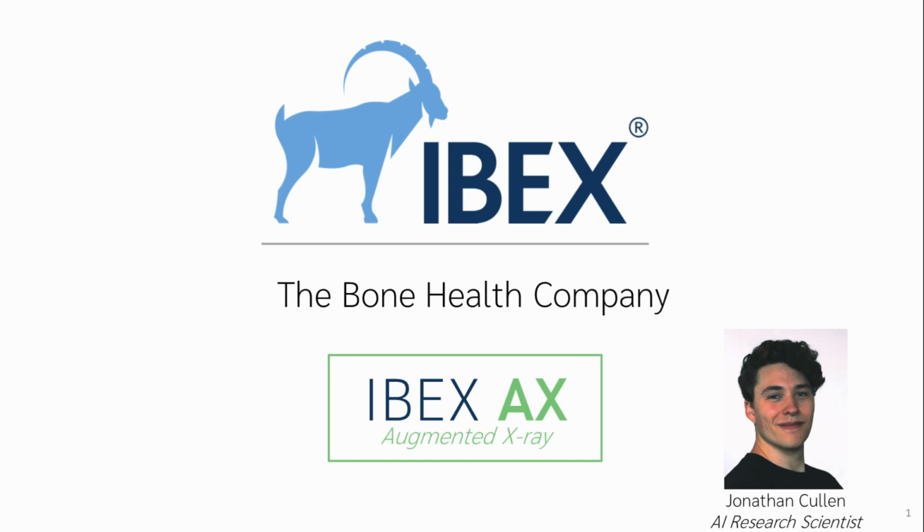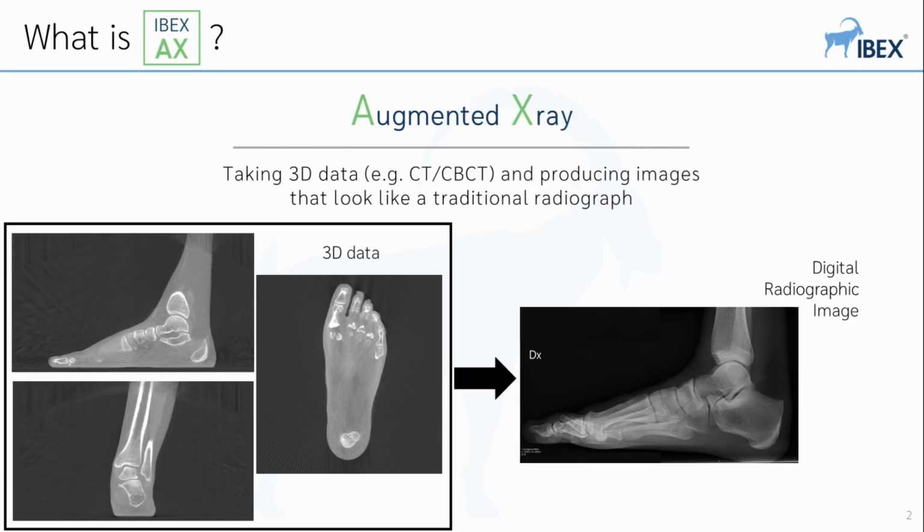So let's take a closer look at what IBEX AX is and how it works. The acronym, as seen here, is Augmented X-ray. The core principle of what AX achieves is to take 3D volumetric data, so the type that might be produced from a CT or CBCT scan, and use this data to produce something that looks more like a traditional radiographic image.